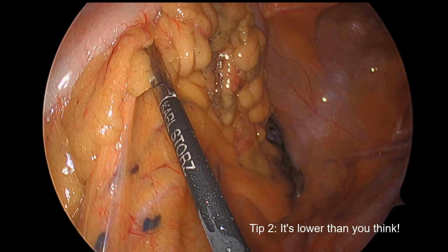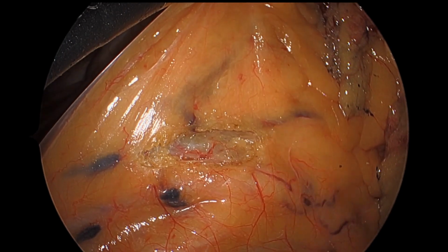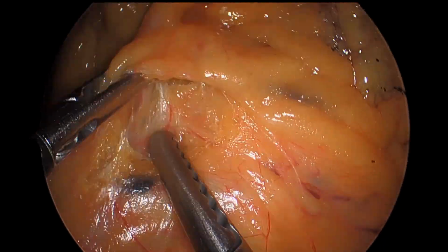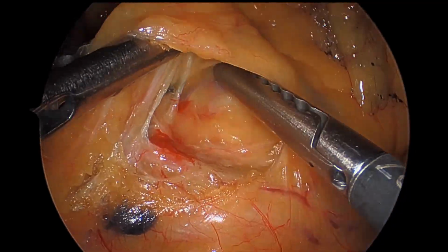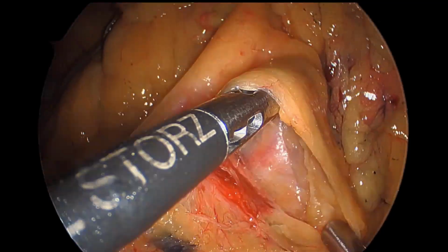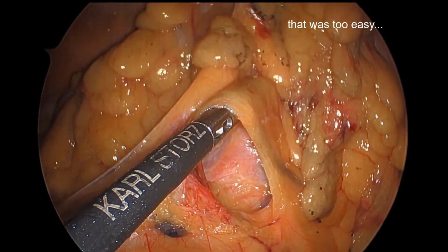So again, it's lower than you think when you're starting the dissection, but we're worried that we're going to get under the retroperitoneal structures, which is a reasonable thing to be worried about. Here we're actually starting our dissection under the left colic, although we think it's the IMA. You can convince yourself here that you're dissecting the right plane. It almost sort of looks like an avascular plane. It almost looks like there's the retroperitoneum that you're sweeping away. But it's too thin. And it's too easy to get into the sidewall. Yeah, like the caption says, it was too easy.